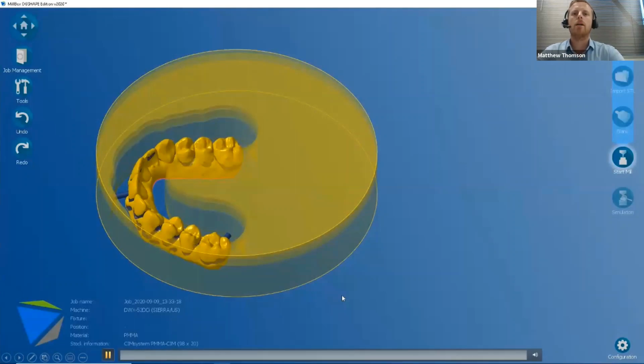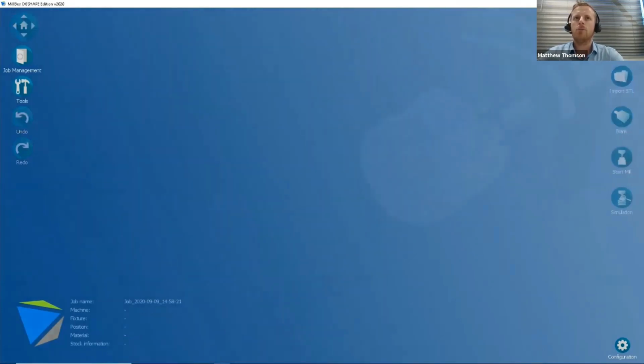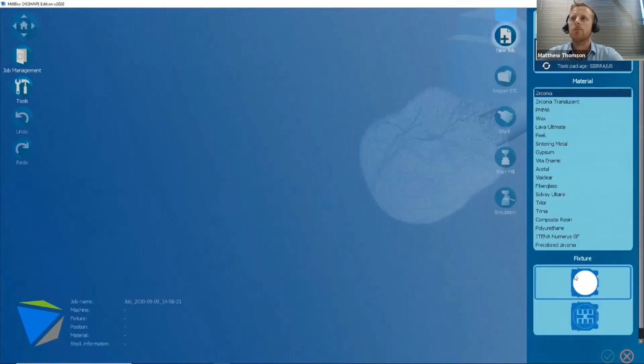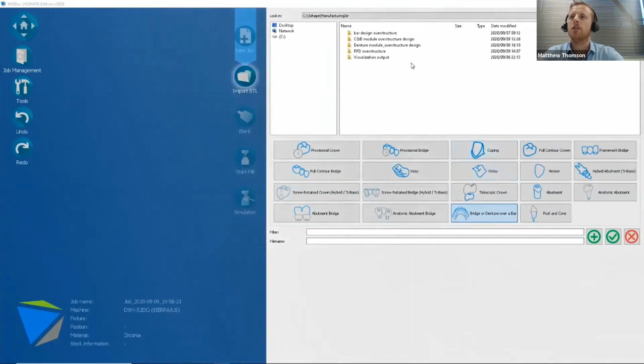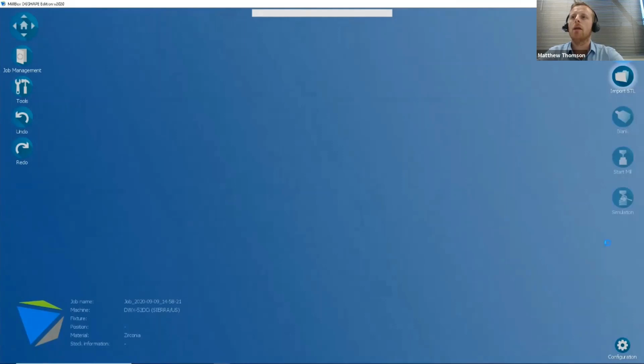So let's just play through this video. I think it's just jumped back, so we'll just catch up again. Good to see again. Choose our job, choose our material, and then choose our object. You can see there's a wide range of materials available for the 52 DCI as well, zirconia, plastic, and wax, etc. So here we go, we've got our over denture from our crown and bridge example. Choose bridge or denture over bar and load that in.